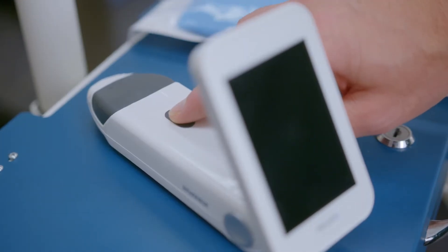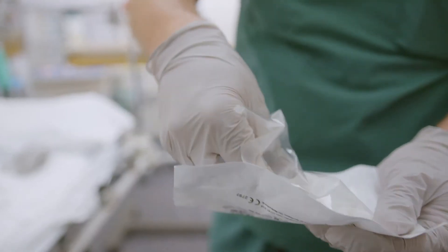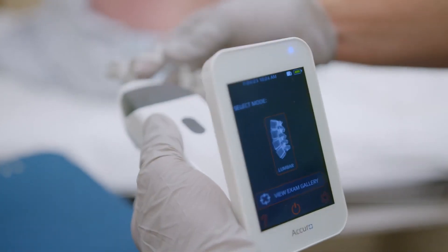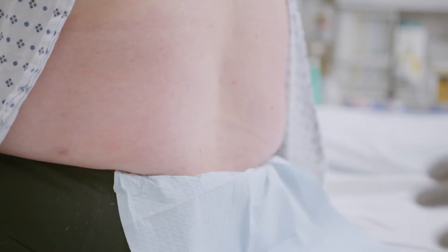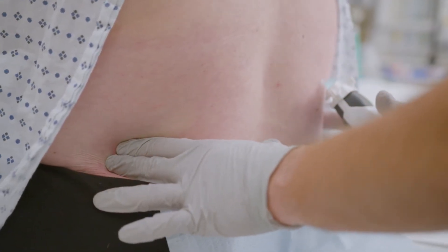Turn on Acuro and select Lumbar Mode. Attach the locator needle guide. Apply ultrasound gel generously. If desired, palpate the patient to identify a starting point for scouting.